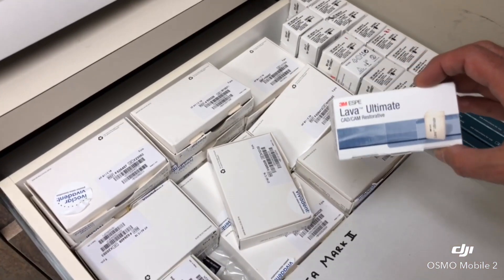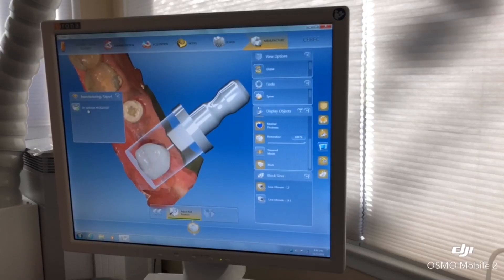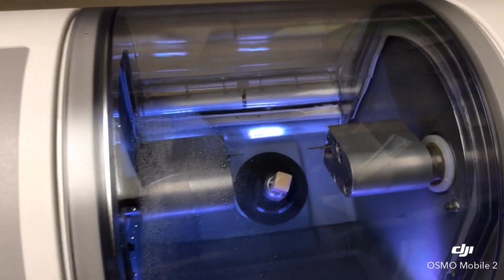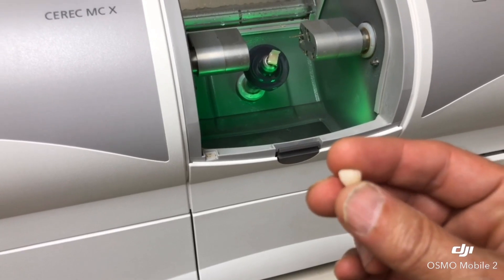We will be using Lava Ultimate, which is a long-term temporary, very forgiving material — it's not as hard as porcelain, and it will serve the patient's needs to chew while the zirconia implant is integrating.